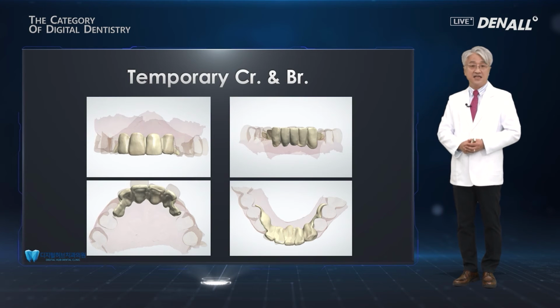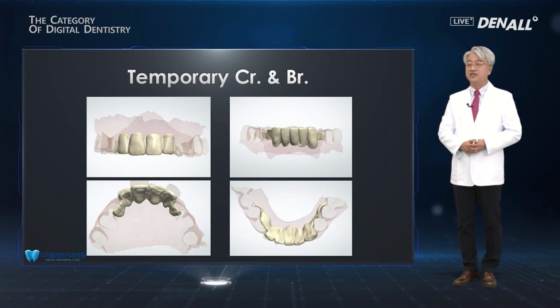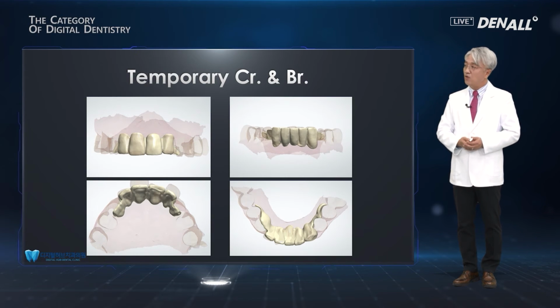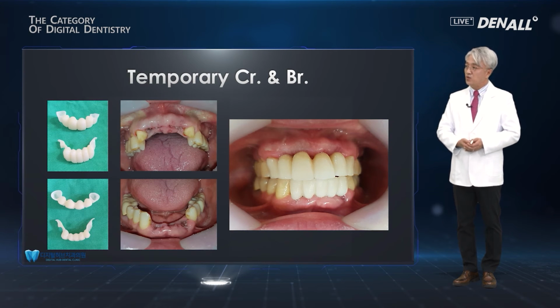And the most widely used case is the temporary crown and bridge or temporary denture, for prosthesis or implant surgery. We use them a lot, so the share of temporaries clinically is very high. With CAD/CAM, a Maryland bridge can be created like this as a temporary, and a ready-made Maryland bridge and general temporary bridge is delivered to the patient.